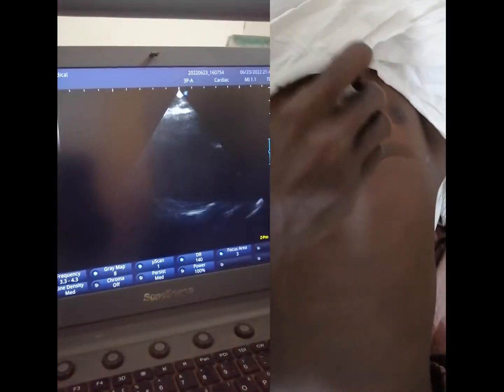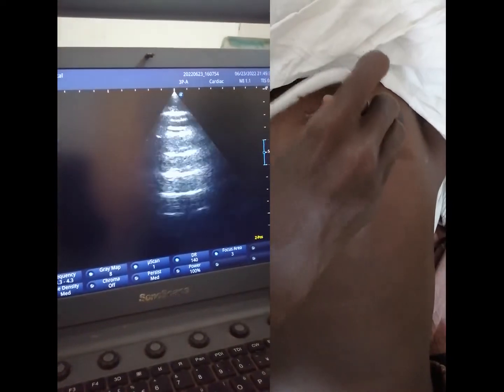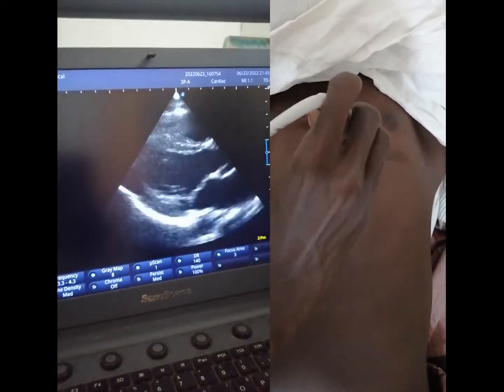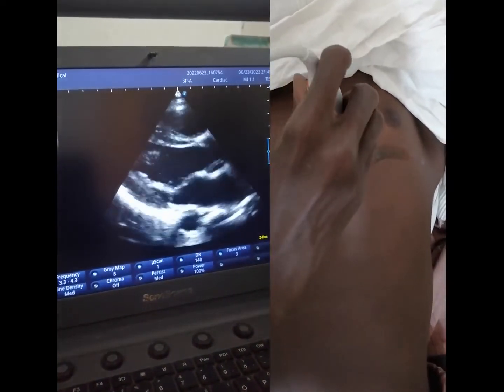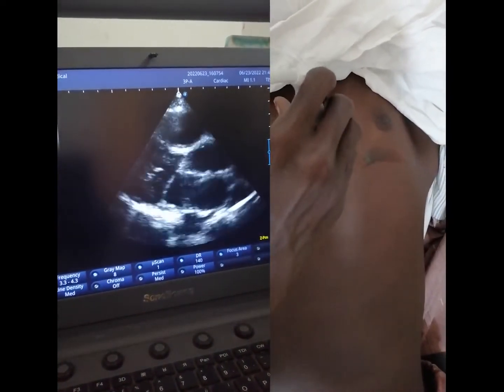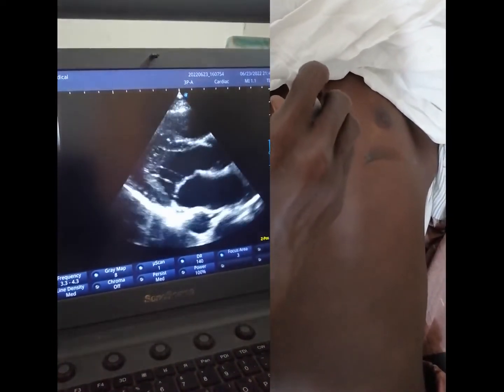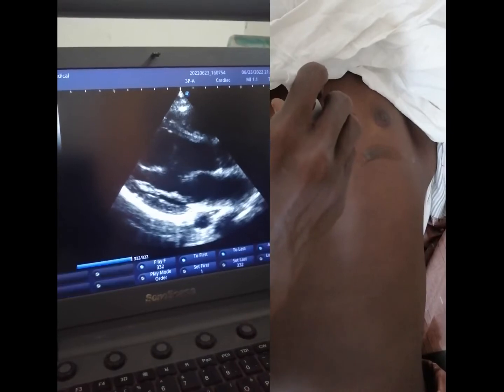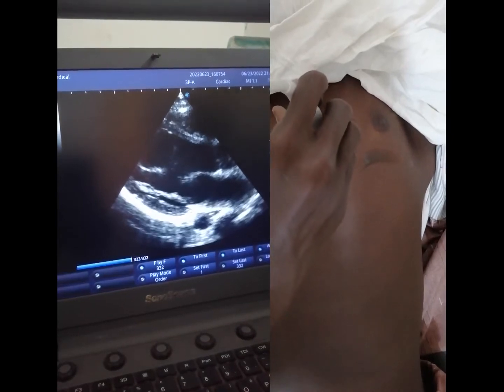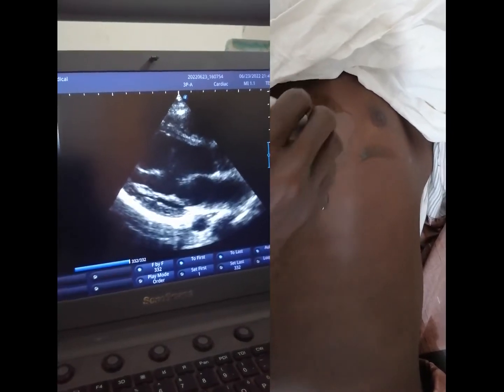This is the parasternal long axis view. That is all for today. We have to try. Thank you.